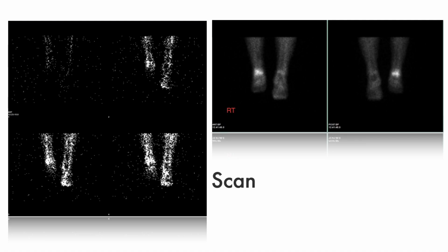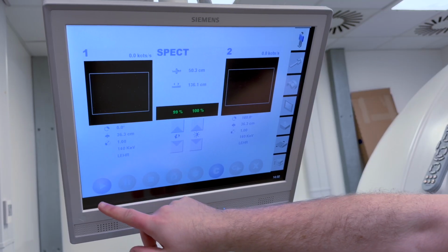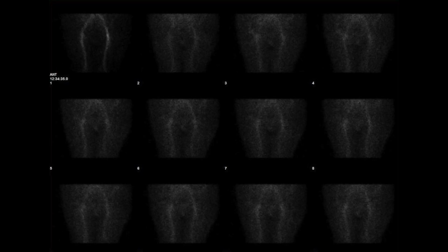In cases of arthritis or bone infections, the approach is slightly different. This is where a 3-phase bone scan comes in. Then the involved parts of the body should be positioned under the detectors. We cannulate and inject the tracer and perform a dynamic acquisition. A dynamic acquisition is basically acquiring multiple images and recording them as the tracer enters the body.